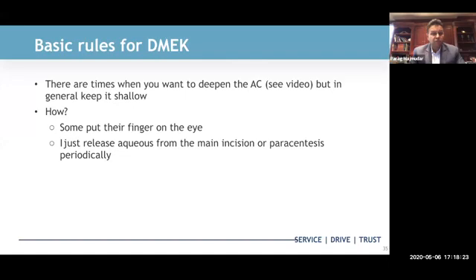Is there vitreous there? I just had a case before all this COVID madness started where I did a routine DMEK. I mean, it should take me about 10 or 15 minutes. And I got in there, got the graft in there, and it just would not open. And this is a patient who had had an IOL put in probably 25 years ago. And due to whatever forces that were going on, there was vitreous in that chamber. And I had to remove the graft, do a vitrectomy, and then the graft unfolded and attached very well. So pay attention to that. There are reasons why the graft is not unfolding.